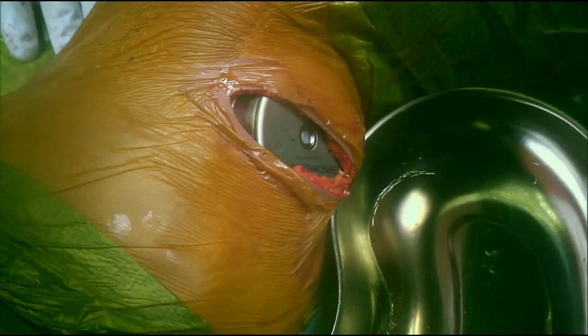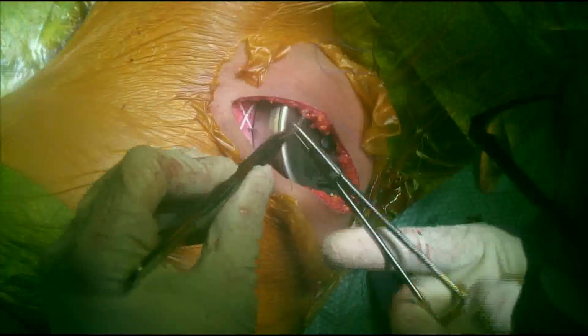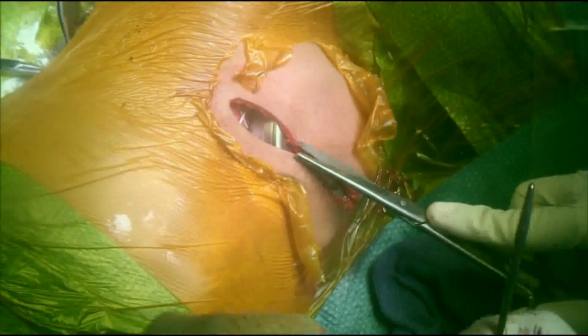Before starting the closure, ensure copious irrigation with normal saline. The video is sped up in the interest of time. Feel free to watch until the end of the closure.